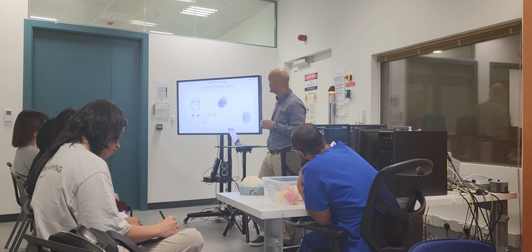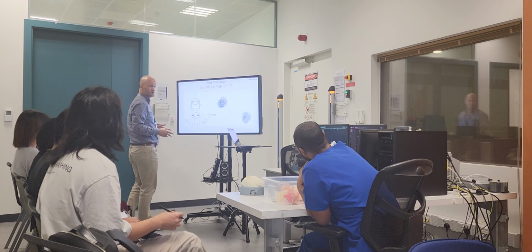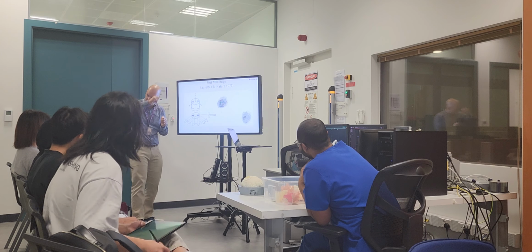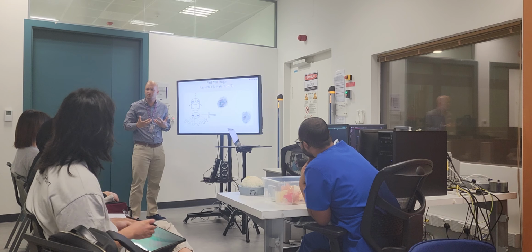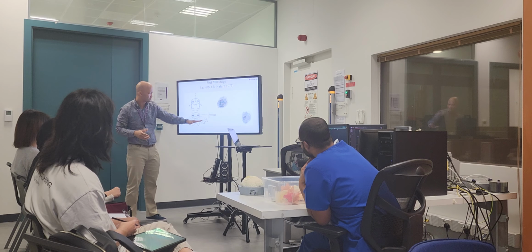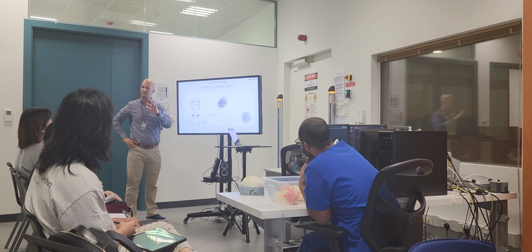Lauterbur came in the 1970s. He modified an NMR spectrometer at night because chemists had to use it in the morning. He added gradients. He wired it himself. He was able to do only 4 gradients: x, y, xy, and z. Just 4 gradients.